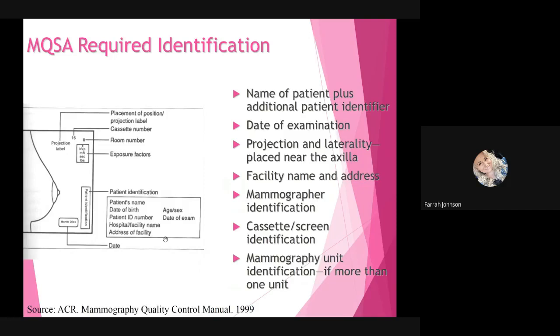It should also say the facility's name and address. It should say the mammographer's identification, so typically your initials, just like you would use in x-ray. We do not use physical letter markers, so you will just log in under your account, and that is what will notate your images. Also, cassette and screen identification if needed. However, in the world of digital mammography, this is obsolete. And then the mammography unit identification if more than one unit is used.